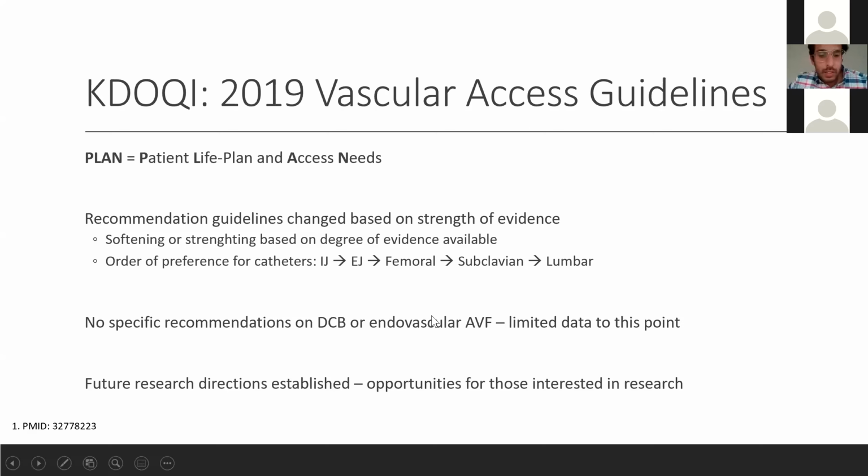There are no specific recommendations on drug-eluting or drug-coated balloons or endovascular AV fistulas, citing that this was done mostly in 2019, so there's limited data to this point on that. And very interestingly, they established some future research directions. And this is really nice because it's important that new research directions have been established for people like myself who are interested in research to see what holds for this field.